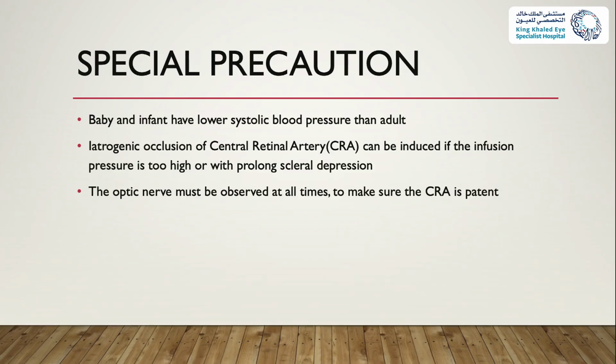Another thing that needs more precaution is that babies and infants have a lower systolic pressure than adults. So when you do scleral depression during the examinations, whether you are doing surgery or examining in the nursery, you need to remember that, and don't leave the scleral indenter there for too long.